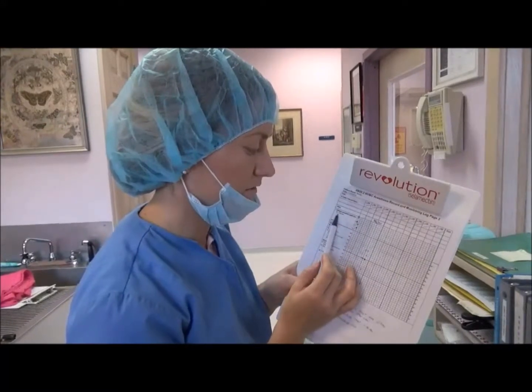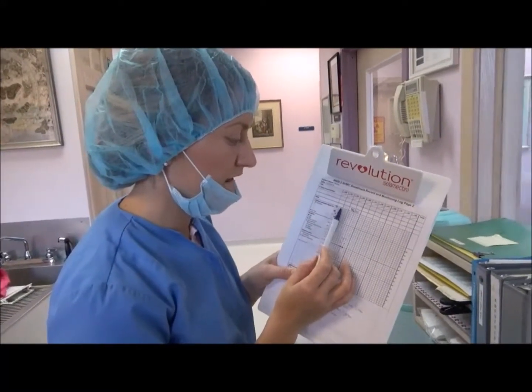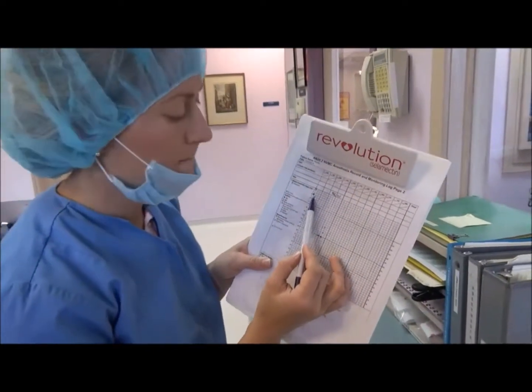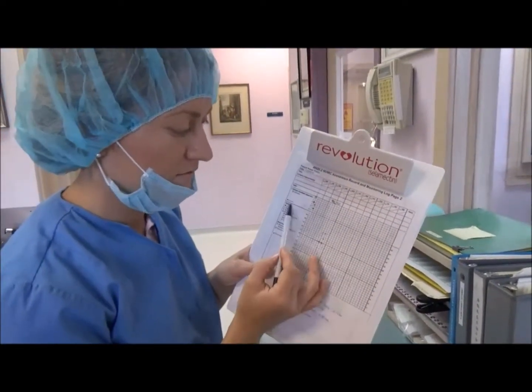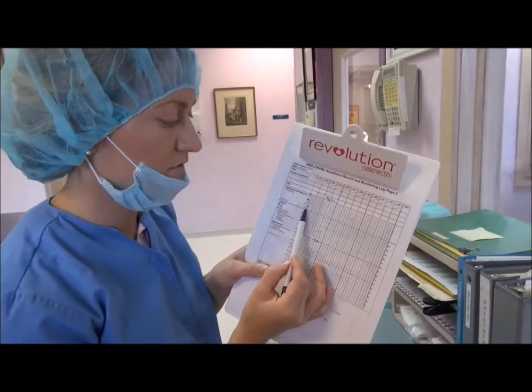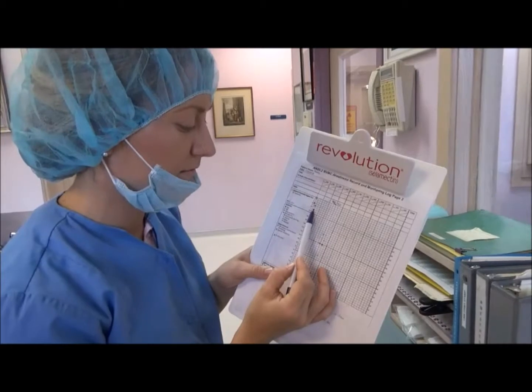Today for our patient we're using isoflurane. We started at 5%, and then at about 3 to 4 minutes we dropped it down to 2%. And our oxygen, that's the gas we're using today, we started at 2.5 liters, and then at the 3 to 4 minute mark we dropped it down to 1 liter.